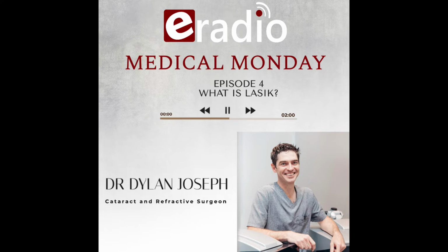Yeah. And as I said last week, laser vision correction or ophthalmology is one of those fields that is expanding at an incredibly rapid pace. So once this LASIK flap has been created, we then move you under the second laser, which is the one I referred to right at the beginning. That's the excimer laser, the excited dimer laser. Now, what this laser does, and this is the crazy thing, I mean, the science behind it is developed by NASA scientists.